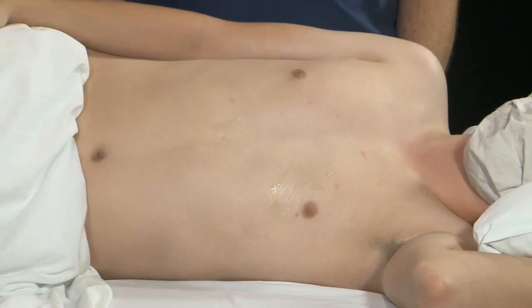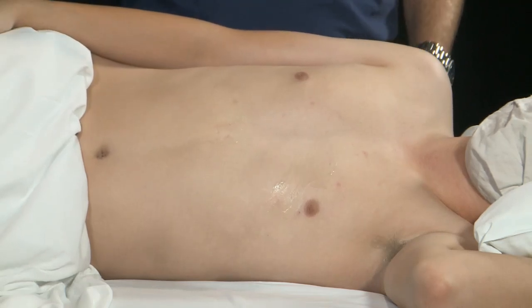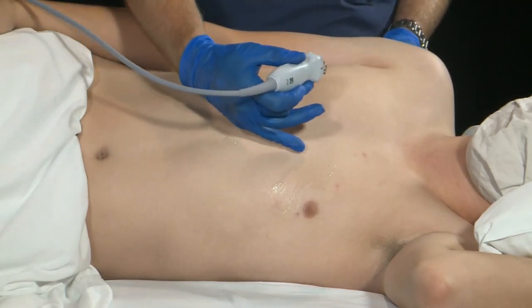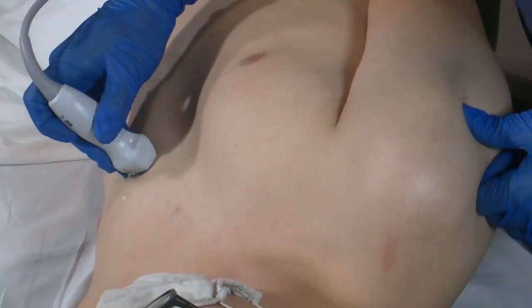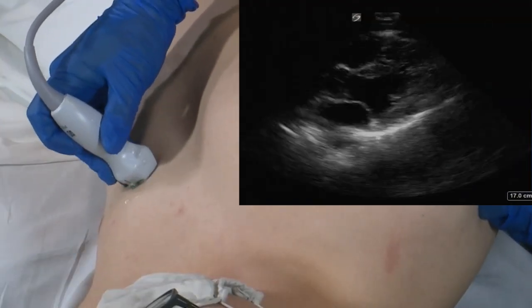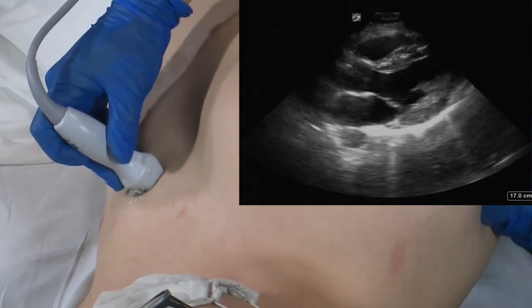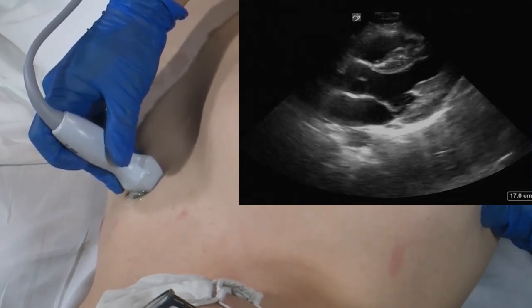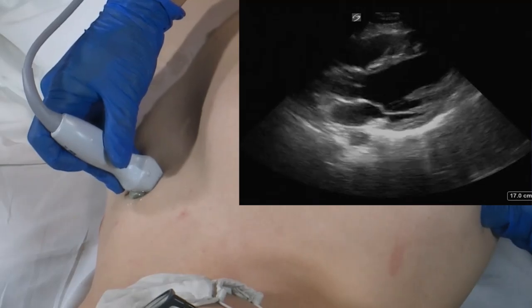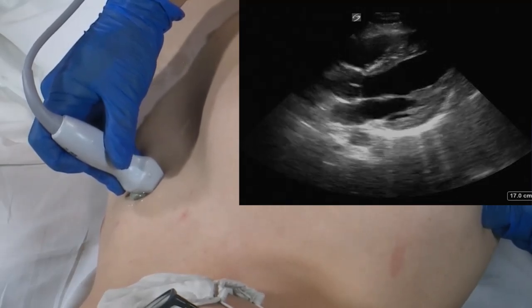For the parasternal long axis view, we're going to place the transducer immediately lateral to the sternum with the marker dot aimed towards the patient's right shoulder. In this orientation, we're going to move the transducer so that we can see the right ventricle, the aortic root, the left atrium, the left ventricle, and the anterior leaflet of the mitral valve.